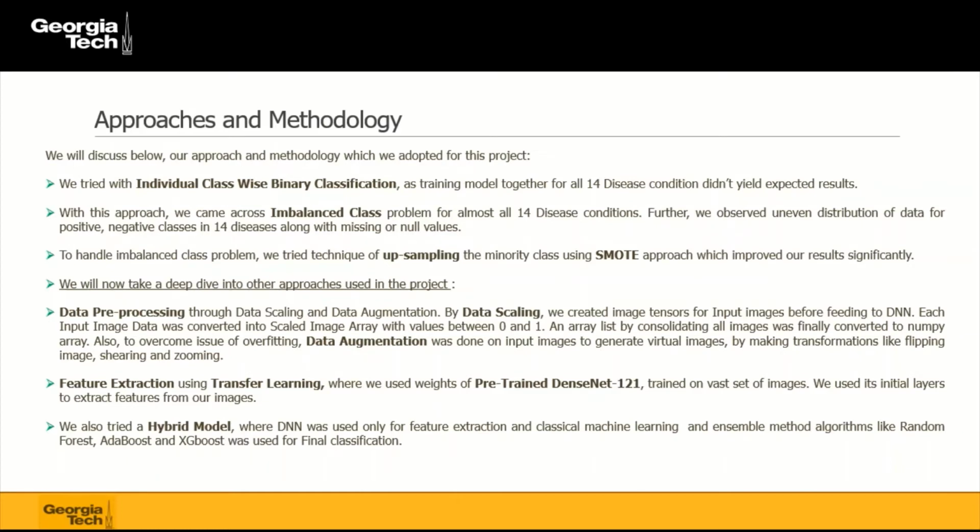But we have also tried the hybrid model, where the deep neural network was used for feature extraction, and classical machine learning and ensemble methods like random forest, AdaBoost, and XGBoost were used for the final classification.